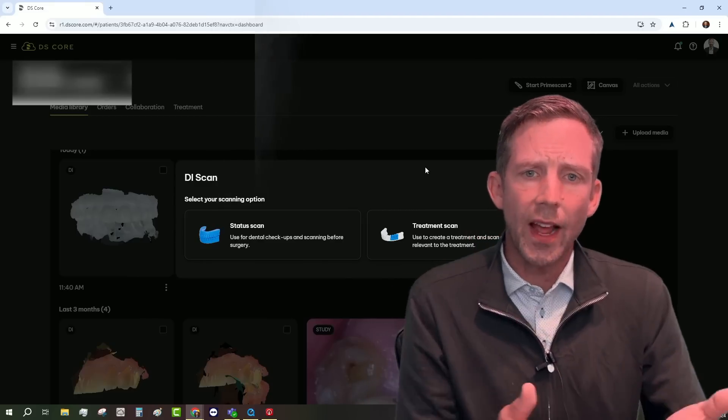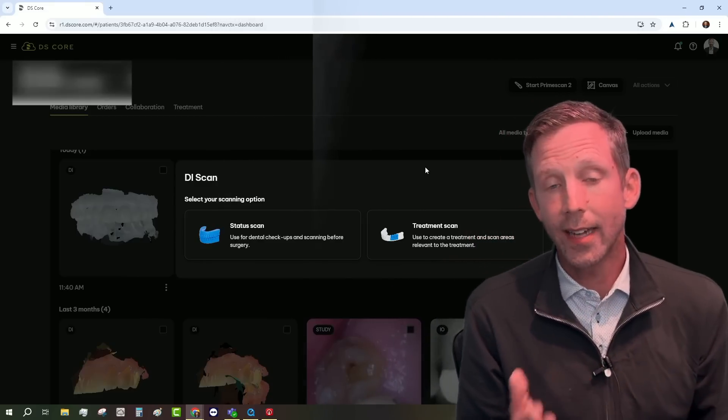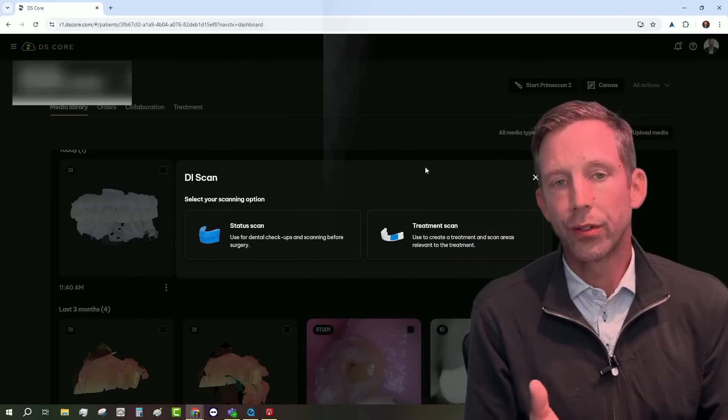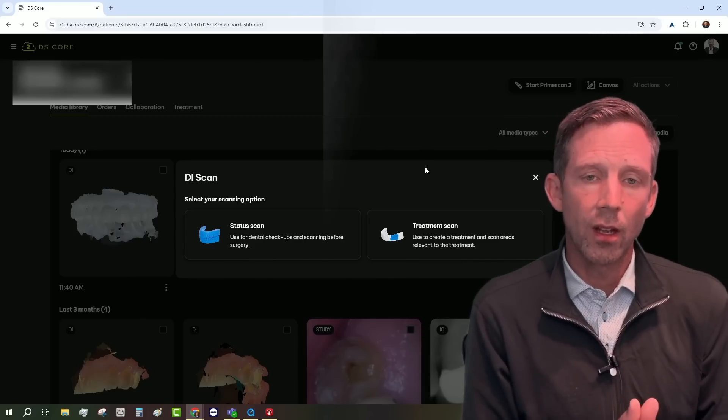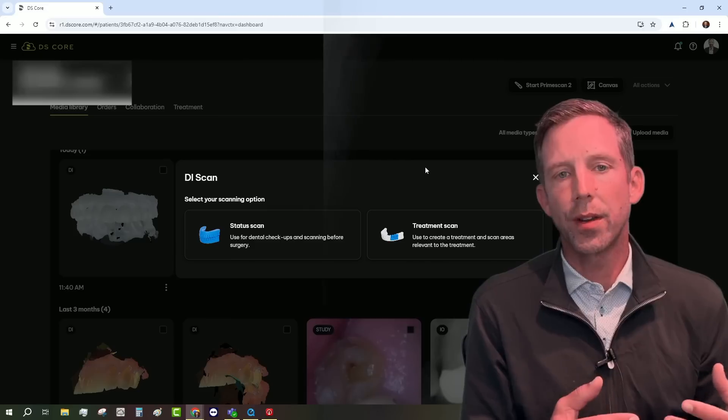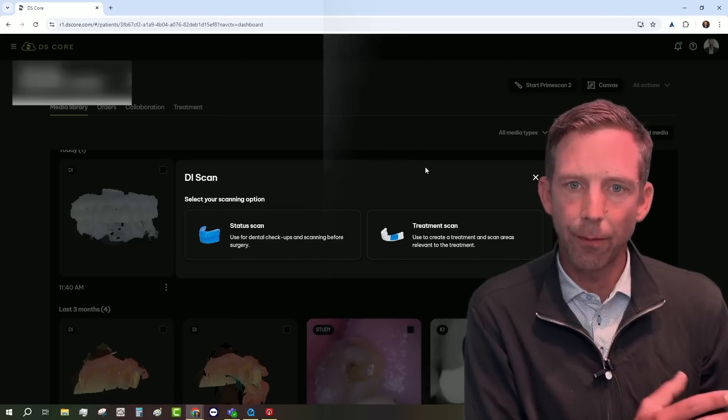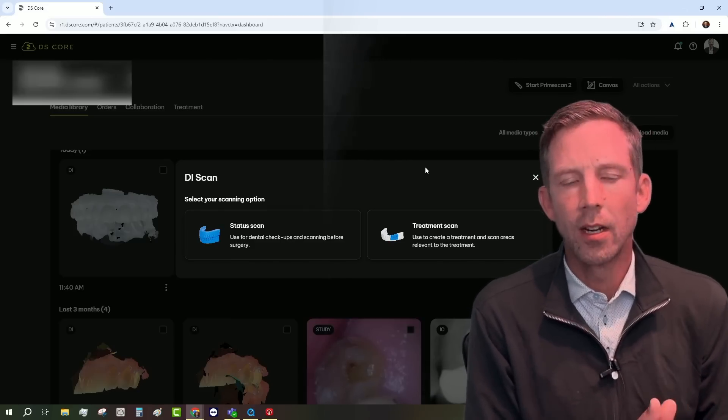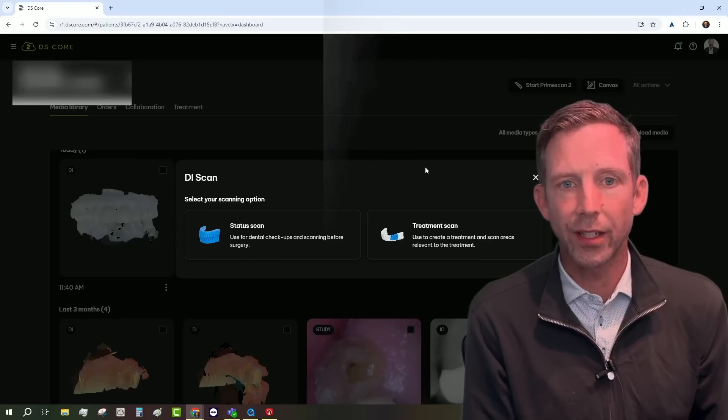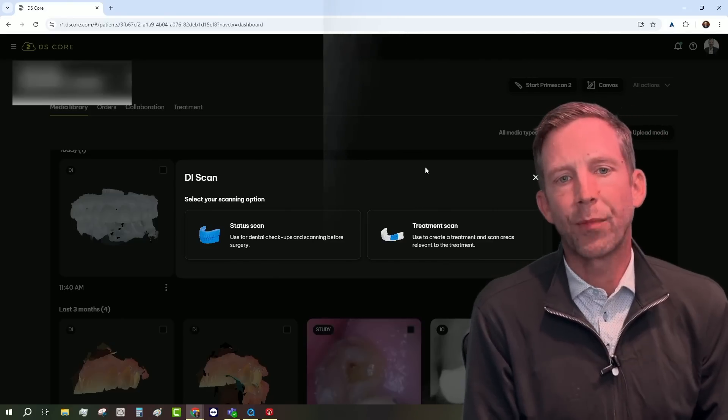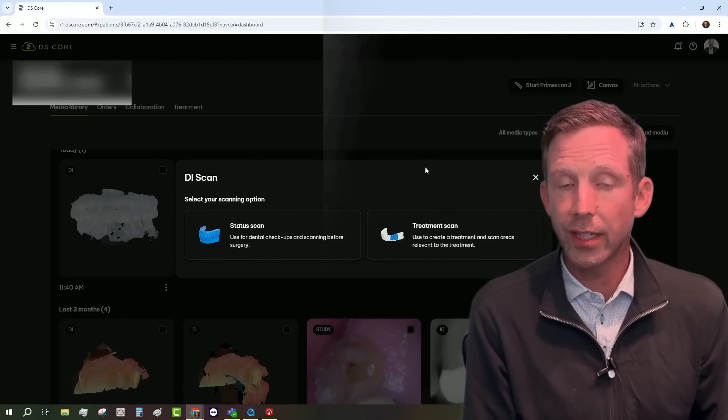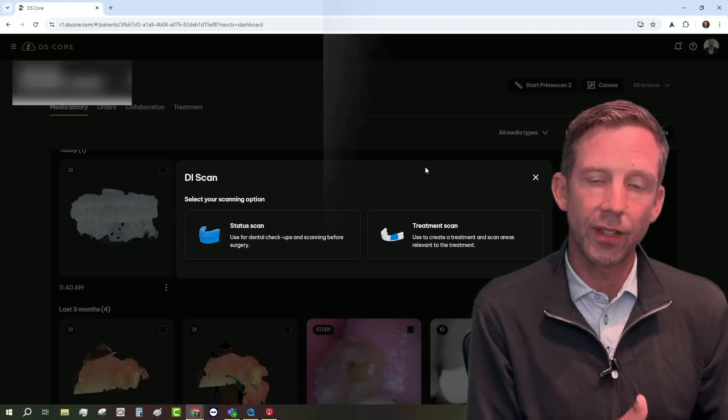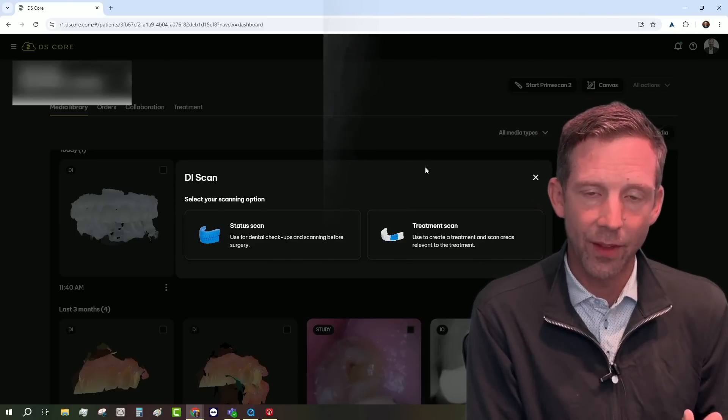Now, what it's gonna ask you is, do you want to take a status scan or do you want to take a treatment scan? So what is the difference between these two? So a status scan is going to be scanning a patient in that particular moment in their timeline, right? So if I'm scanning a new patient or a recall patient, or just a patient for treatment planning, and I want to show them how their teeth are right now, then I would choose a status scan.